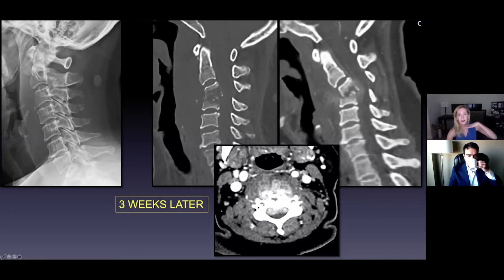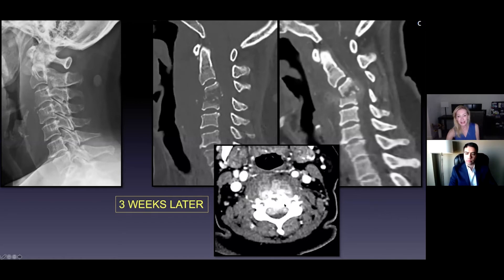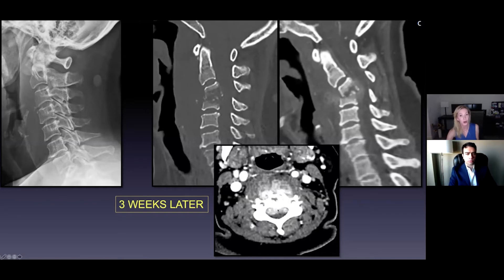This is an axial view cut straight through at that level. You can see the vertebral body, the posterior elements, and the spinal canal. There is abnormal enhancement in the front of the spinal canal, which is epidural — it's phlegmon, which is inflammatory tissue on its way to becoming an abscess — and prevertebral phlegmon or abscess as well.